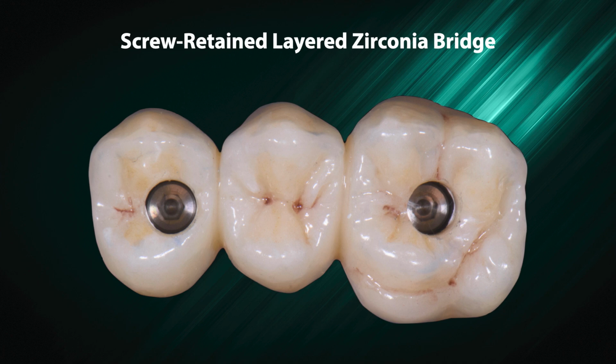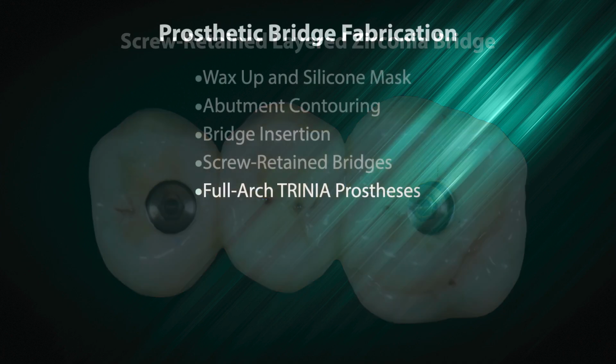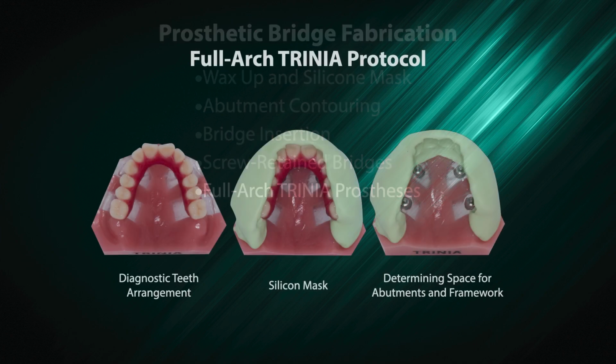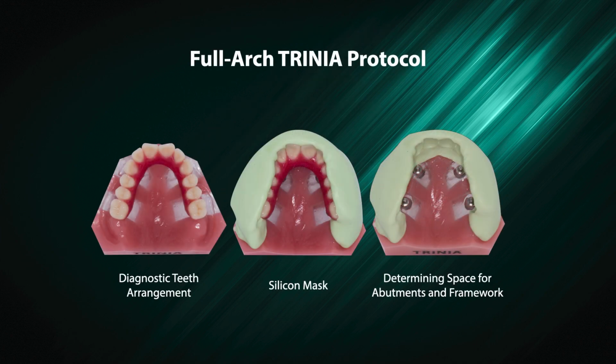Screw retained layered zirconia bridge. Full arch TRINIA prosthesis. Full arch TRINIA protocol.